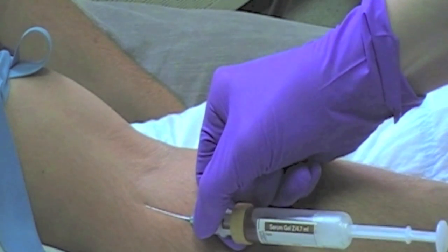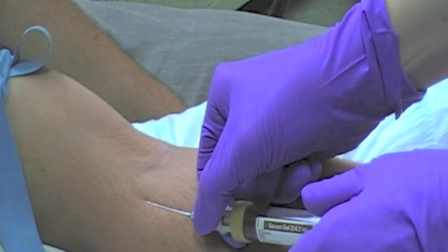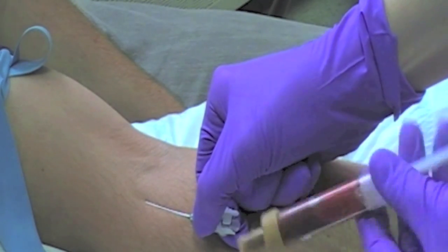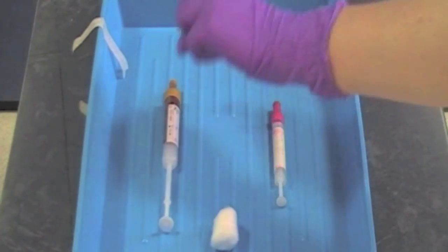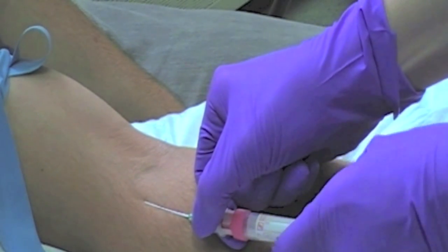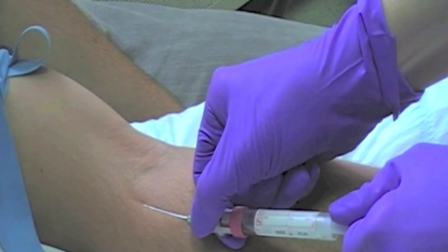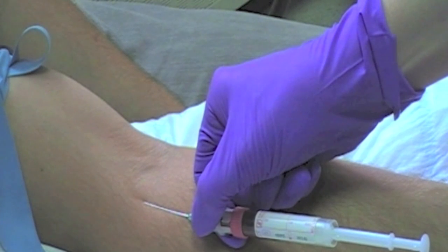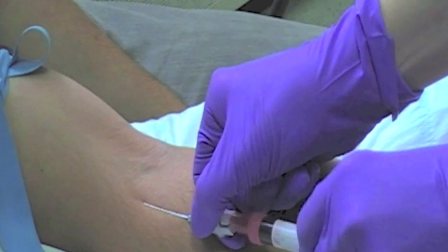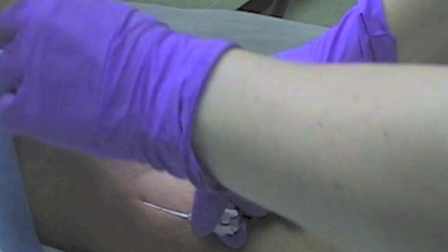Fully withdraw the plunger, allowing the bottle to fill with blood. If you require further blood samples, turn the sample bottle anti-clockwise and separate from the needle. Invert the bottle gently and place in your tray. Attach the second and subsequent blood sample bottles to the needle. It is important that you hold the hub of the needle firmly during the changing of the bottles. Once you have filled all the required blood sample bottles, remove the last one from the needle and release your tourniquet.